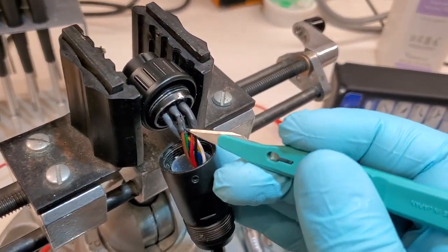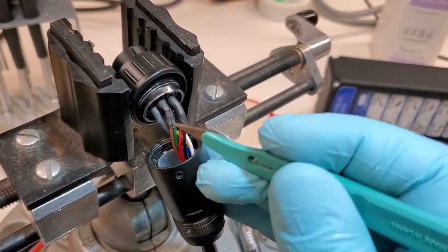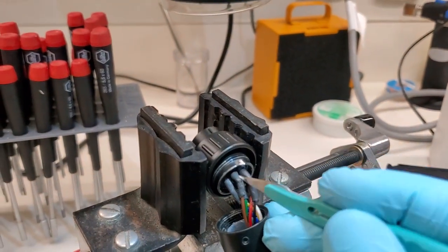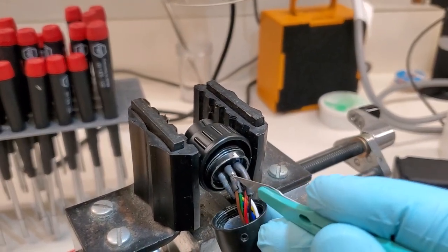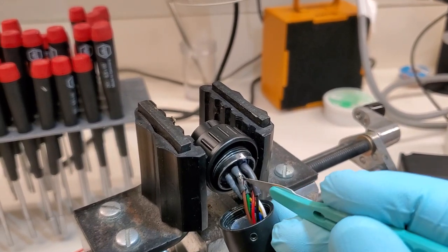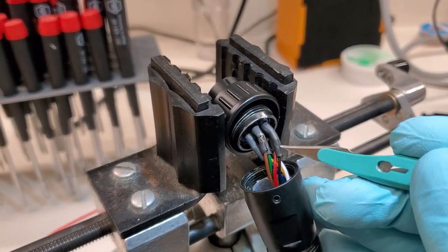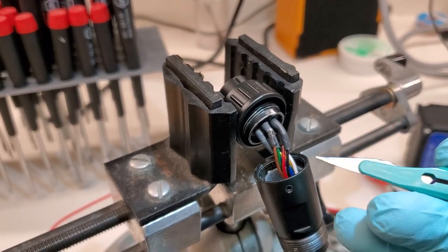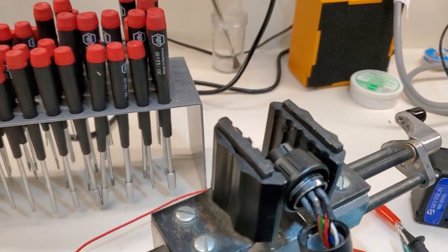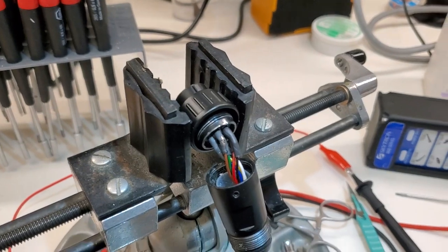I use the scalpel to go in and separate the heat shrink tube. I'll pull it away. You can see right here that the wire is damaged. So I'm just going to go in and fix that wire and check it out again.